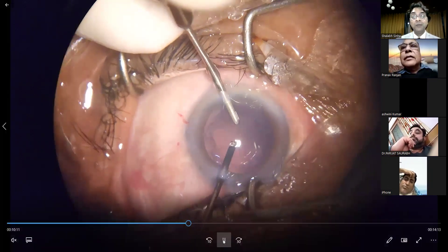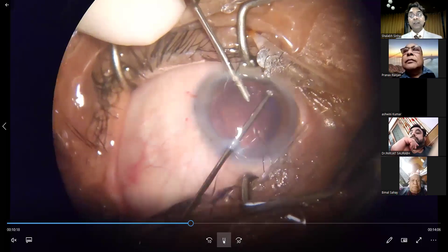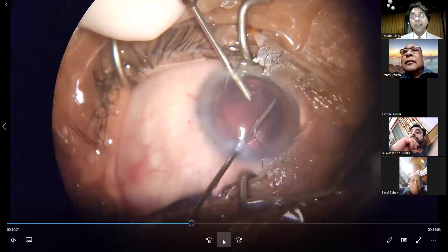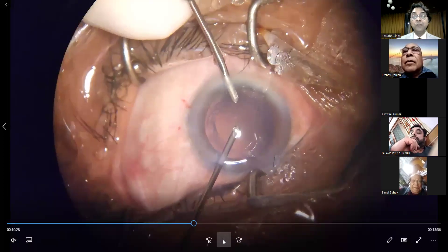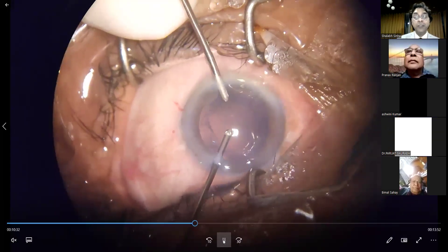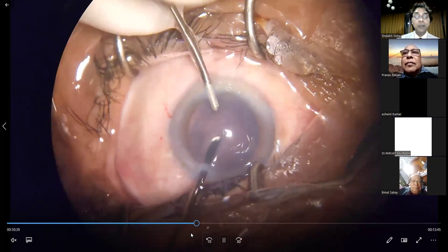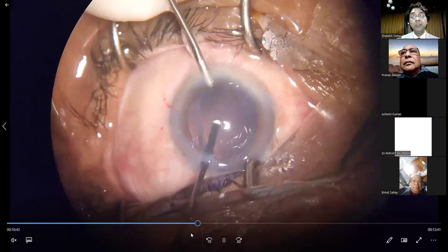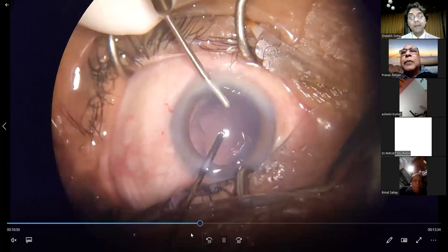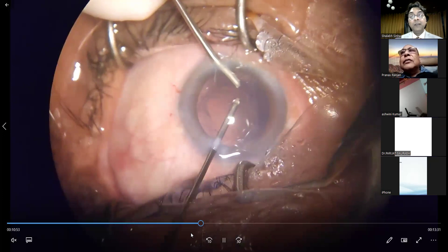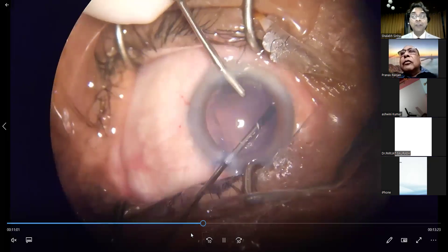Continuing with the removal of vitreous, and then using the cutter itself as an irrigation-aspiration probe, you can remove the leftover cortex. Once you've done your anterior vitrectomy, whatever residual cortex remains must ideally be removed, because leaving behind cortex will cause inflammation. Sometimes the cortex can fall back into the vitreous. The ideal parameter for anterior vitrectomy is a cut rate of around 2500 cuts per minute and a vacuum of around 100.